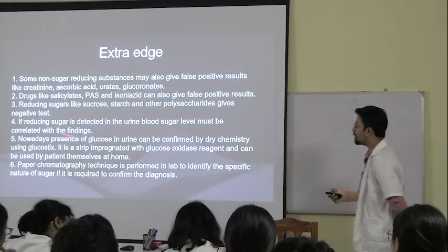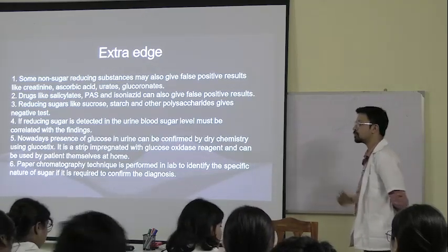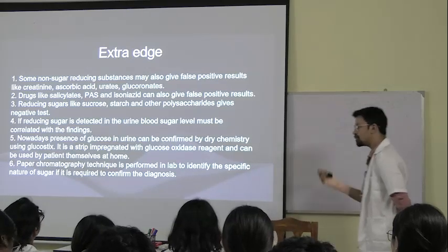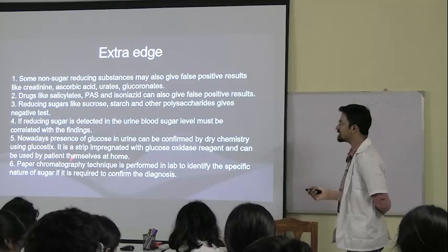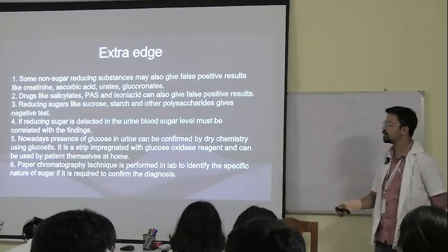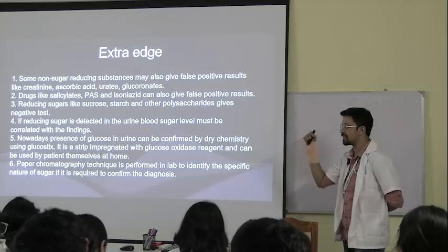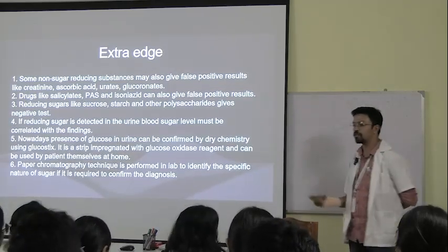Fine. Nowadays, the presence of glucose in urine can be confirmed by dry chemistry. These are some advanced processes that we are doing nowadays, which you people won't be doing in the lab. These are just for your knowledge. Like the glucose stick is one thing that you can take your sample and check the urine sample at your home only, just with a stick. That is glucose sticks.